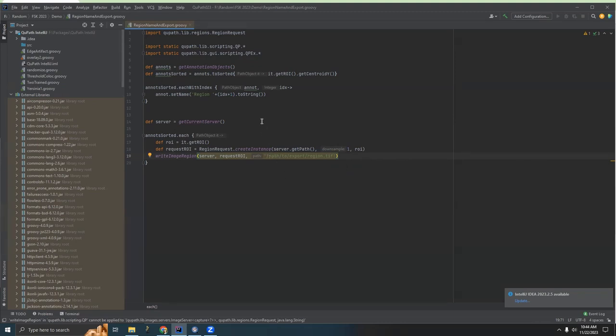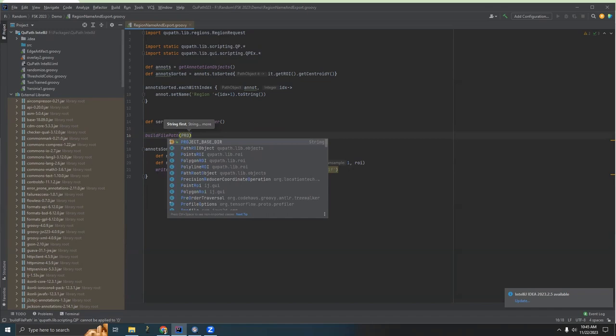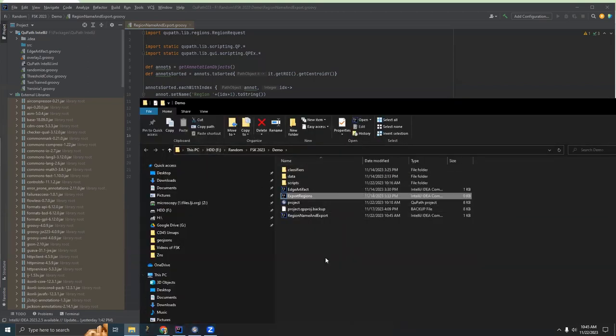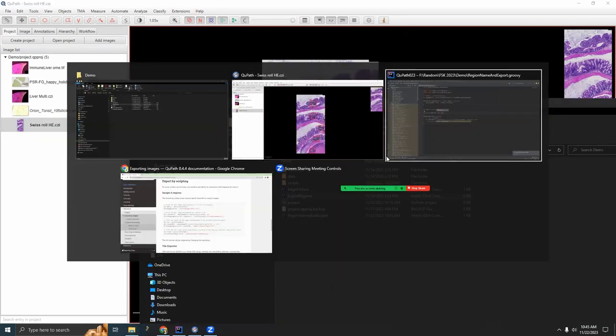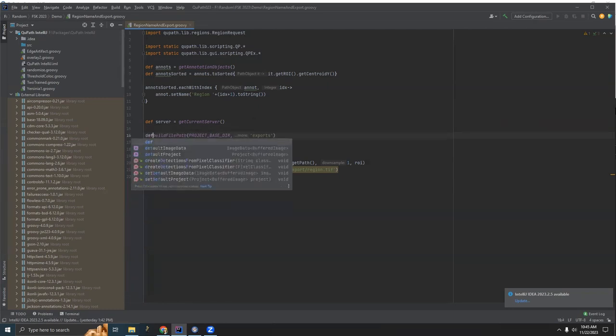First, let's make a folder where we're going to put all of these images. We do that through build file path. And there's a hard-coded convenience variable called project base directory. And this will find wherever your project is stored, which in this case, it's this folder. It's wherever this open directory project takes you. And then I'm going to make a subfolder inside of that called exports. And this is going to be called export folder.